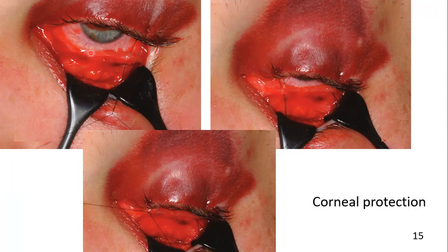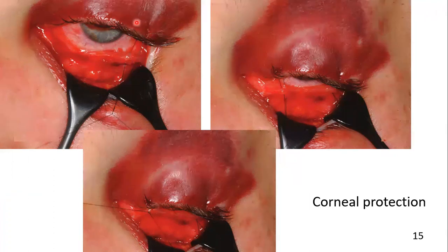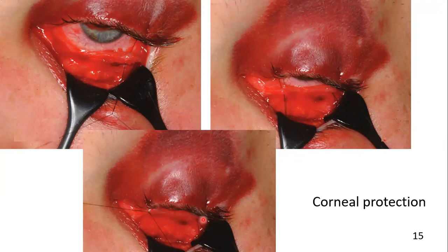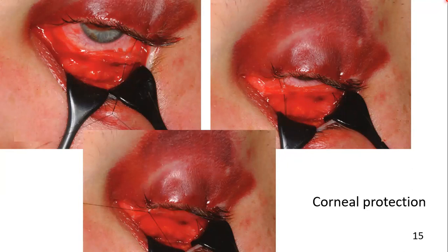Here you can see the canthotomy edge of the conjunctiva being sutured with the upper lid. Here you can see it being sutured completely. But remember that while you suture the canthotomy end with the upper eyelid, you must remove the shield that is used for the protection of the cornea.